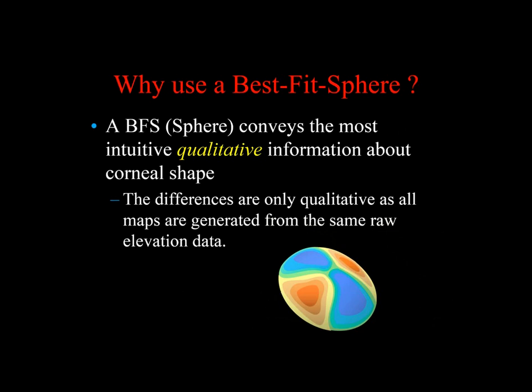Okay. Why do we use a best fit sphere? As I said, it doesn't affect accuracy. It's qualitative. It gives us the most intuitive, qualitative information. You can look at it and you can get a feel for what the shape of the cornea is.